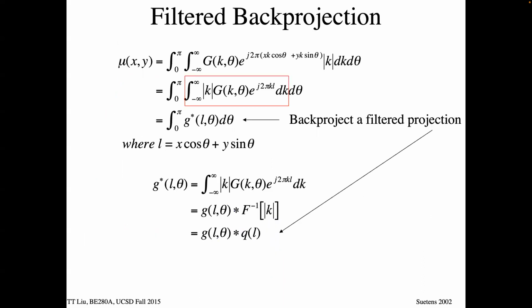No, it came up right here. We just derived why you need that filter, right? It in fact is, because we're sampling the data in polar coordinates, and we have a high dense set of data at the origin and lower density as we go out, it has to be weighted like this in order to get the right numbers, right? And not blur all the edges, right?